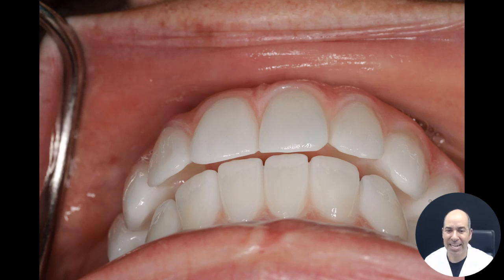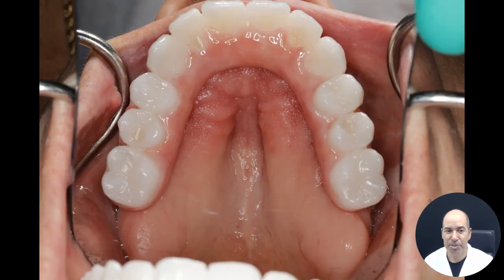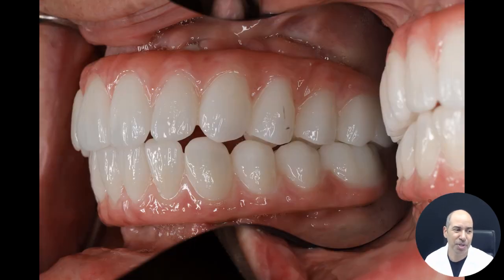And here's her bite, a little bit of an overbite like she had before, which we need to sometimes reproduce. Here's the arch form, nice and smooth and white, and she's got 12 teeth on the top and 12 teeth on the bottom. The screw holes are closed. These are all held by screws and multi-unit abutments. And I'm very proud of it. It's a beautiful case. And I'm so glad that she's allowed me to share this with you.